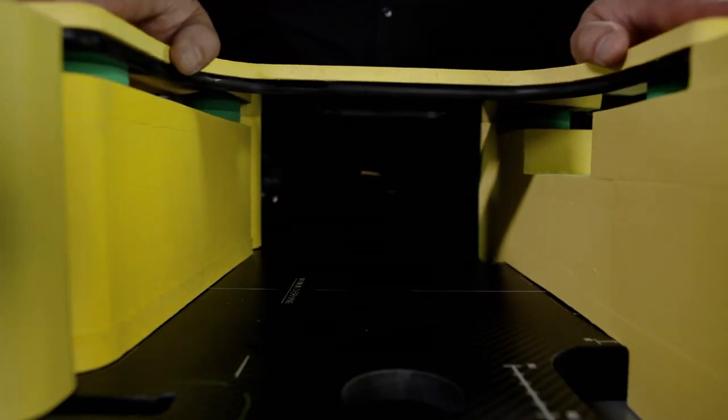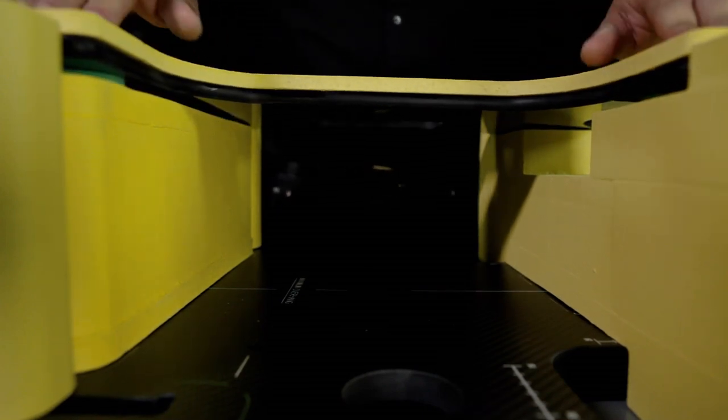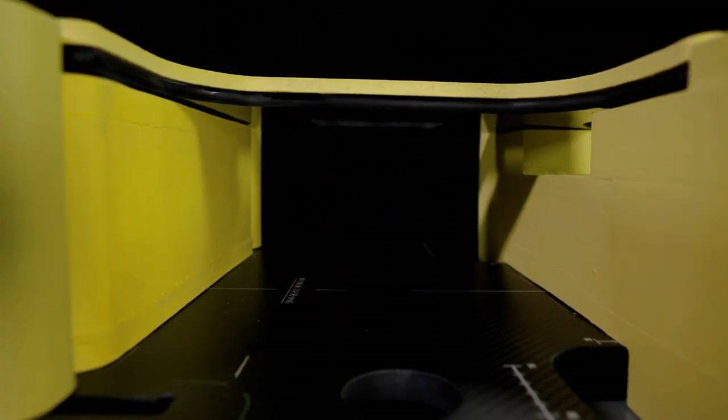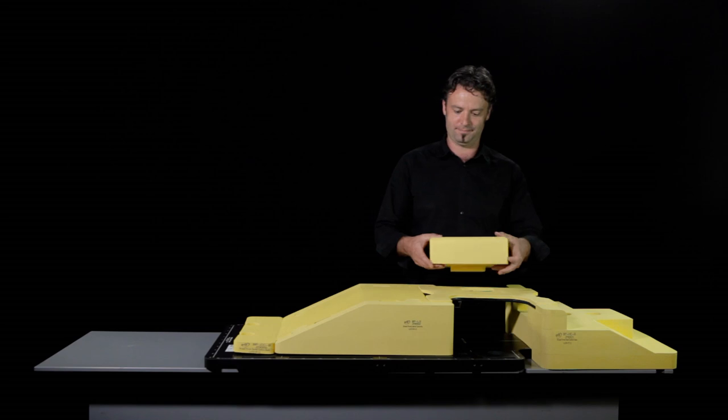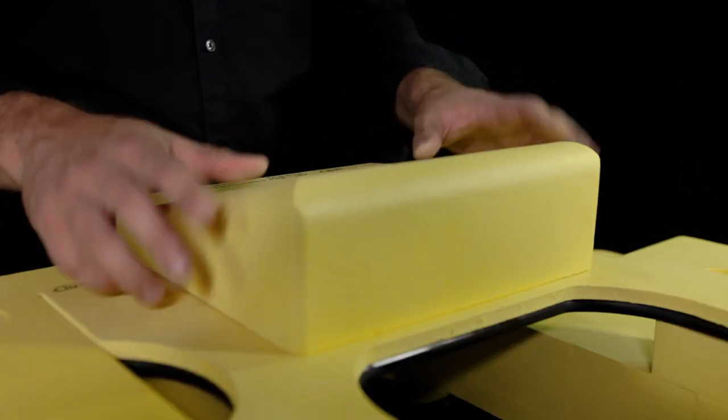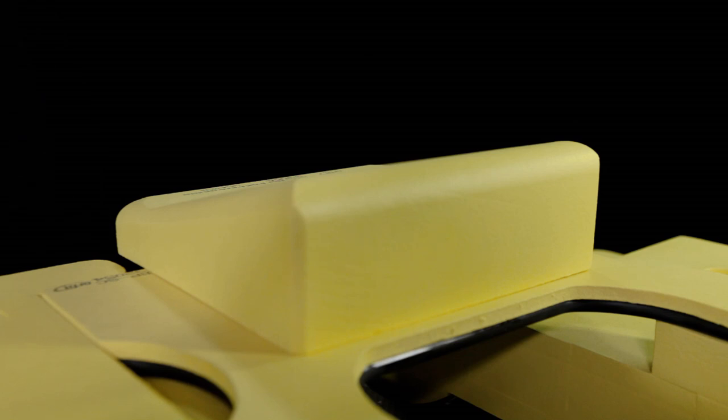Place the bridge plate, which consists of a laminate carbon plate, covered with a cushion between the cranial and caudal cushions. Position the contralateral wedge, which is made of soft foam, to prevent the healthy tissue of the contralateral chest and the ribcage from getting in the tunnel.